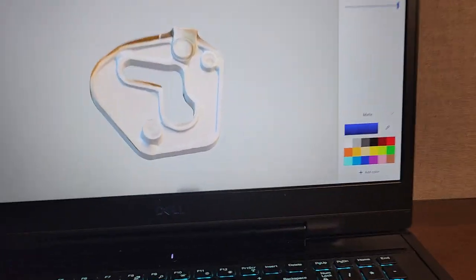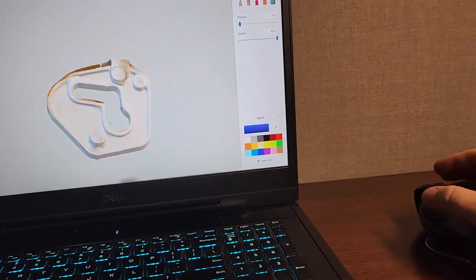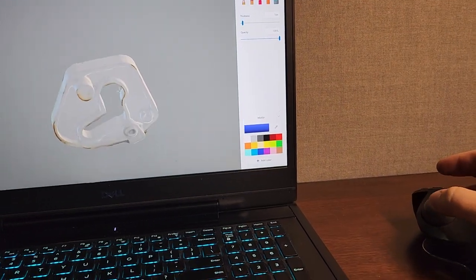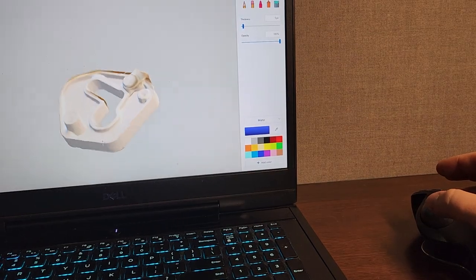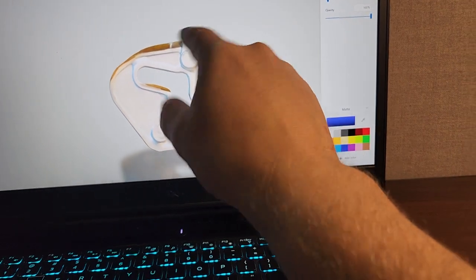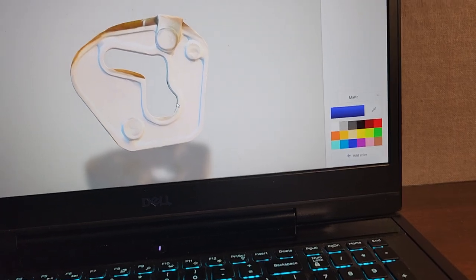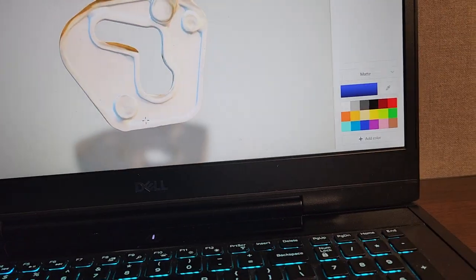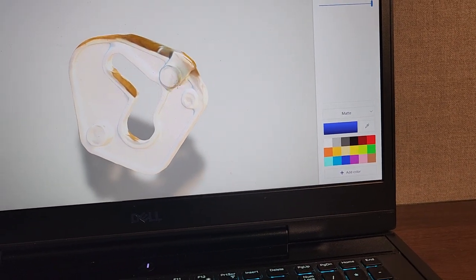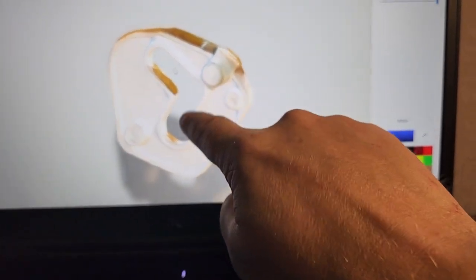All right guys, so this right here is the 3D scanner. I have a 3D scanner that I got from the guys over at CBET, the College of Biomedical Equipment Technology. And the good thing about a 3D scanner is it shows you the scale perfectly, and that means the main attributes of the model. Now, this is not the best model that I had, but I just whipped it up real quick to show you one of the sample scans that I did. You can see that the holes are full. So I need to take measurements of the holes. I need to take measurements of the physical spacing here.